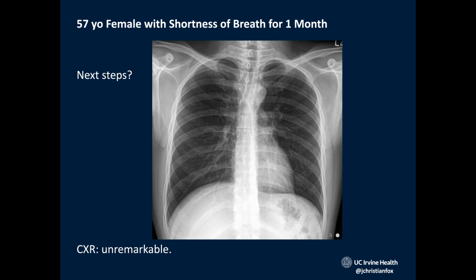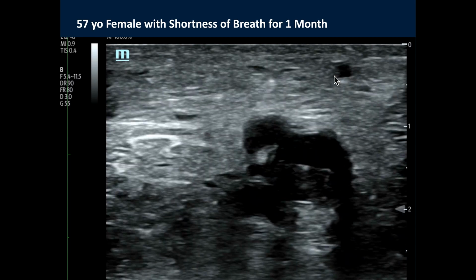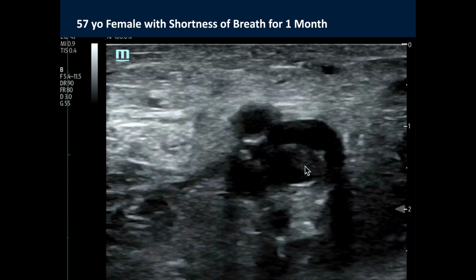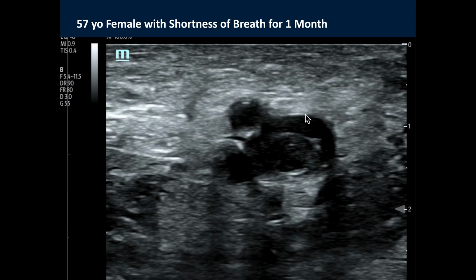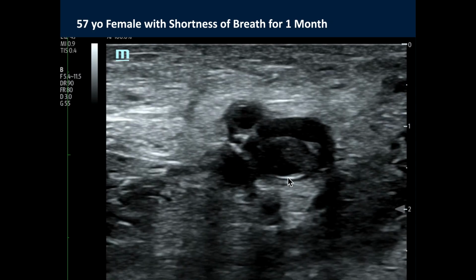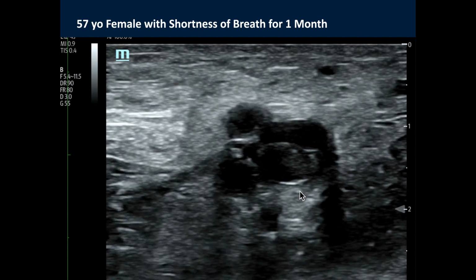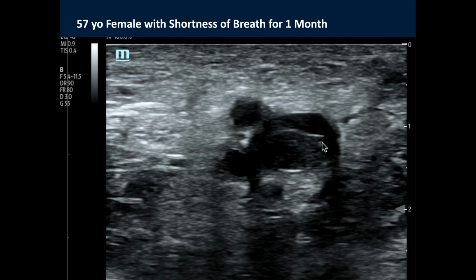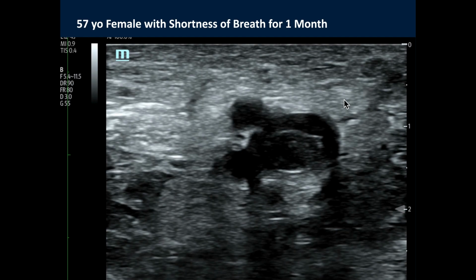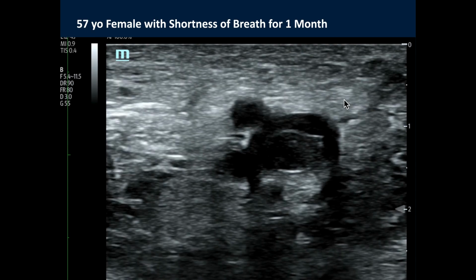Get a chest x-ray, it's not helpful ever. And then we're looking at the leg here, that right leg. We can see that there actually is a non-compressible clot here, non-occlusive as well. So here's this common femoral vein right here, and we're compressing it, and we see an echogenic structure in there that prevents the coaptation or the collapsibility of that common femoral vein. But it's also non-occlusive, so the blood's able to get by here, and you know what? That's consistent with the blood clot that's been kind of hanging around for a month. So it's in some stage of being degraded.